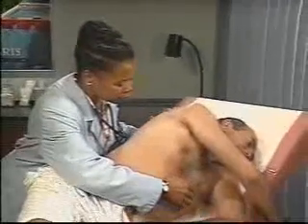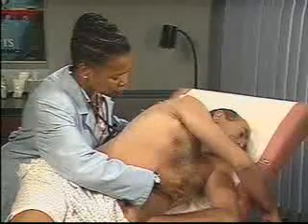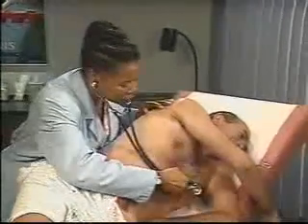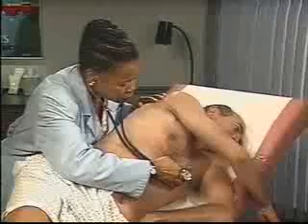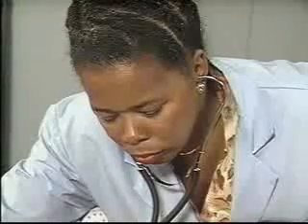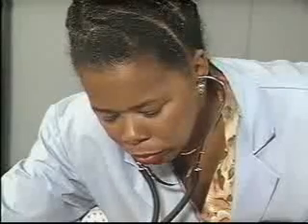To improve your ability to hear S3, S4, and the murmur of mitral stenosis, have the patient roll partway onto his left side, which brings the left ventricle closer to the chest wall. Then recheck the position of the apical impulse and place the bell lightly on it.